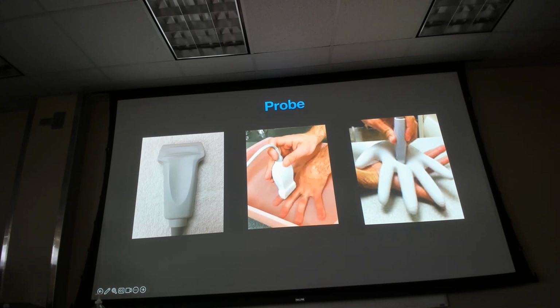Anyway, we're going to use a big gel pillow, just like we do in the ocular exam. For small parts like fingers, you can use a big pocket of gel because you don't want to push on the area of concern or the area that's hurting somebody. Also, you can use water baths. Have you guys ever seen or heard of that? You can get a little tub of water. That's really good for foot and hand ultrasounds, and you don't actually have to touch the probe onto the finger or the toe or whatever you're looking at.